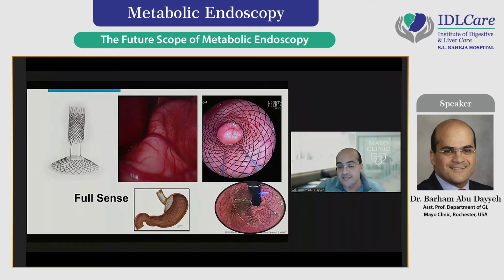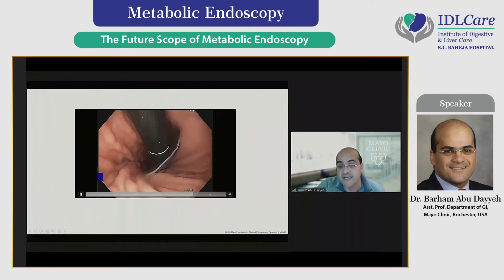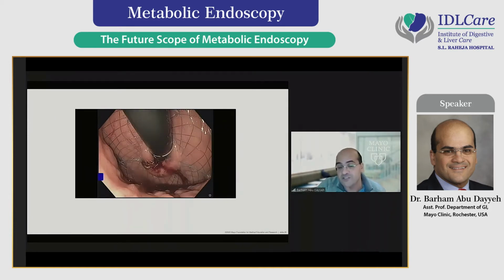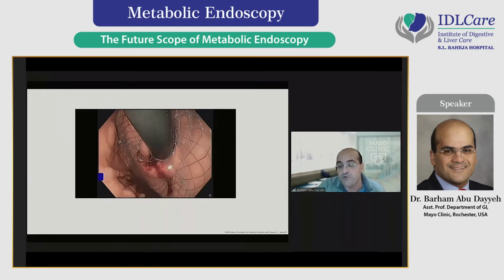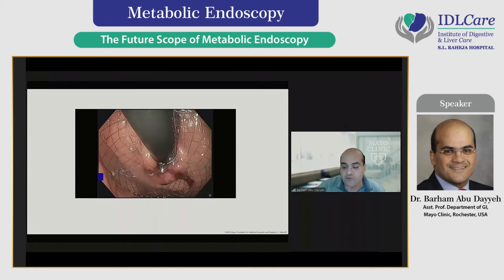So this device is placed as an umbrella, as you can see laparoscopically here, exerting pressure in the cardia, activating these mechanical receptors to trick the central nervous system that the patient is full, and hence the name FullSense device. Therefore, in my opinion, this device would be a very nice, excellent complement to intermittent fasting, because a non-invasive anatomy-preserving device that exerts pressure, as you could see here on the cardia of the stomach, could result in adoption of a robust intermittent fasting program with all the metabolic benefit that comes with that program.